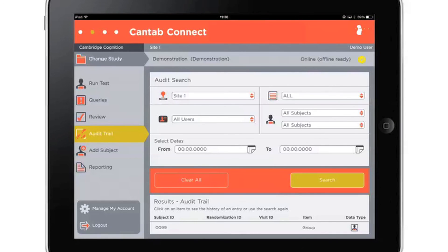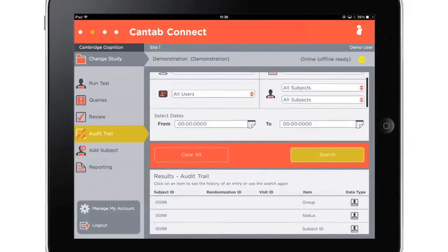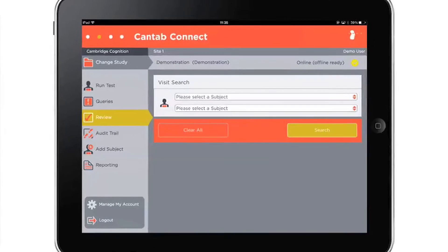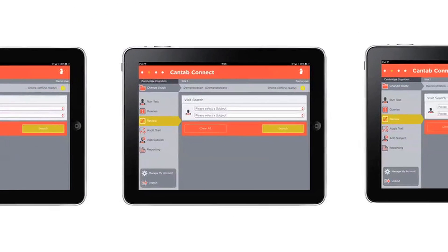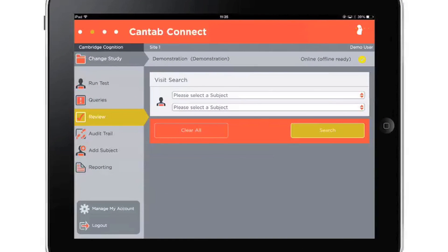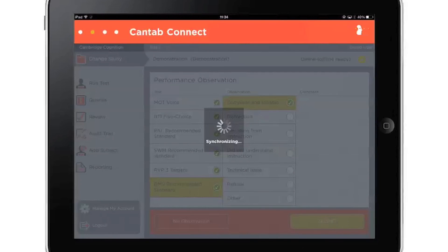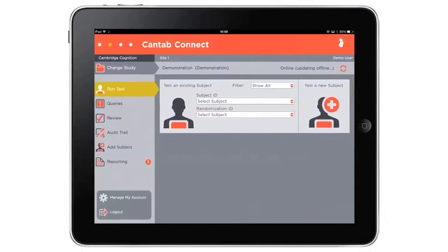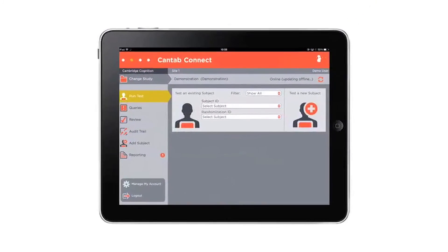An audit trail records all adjustments and tests completed on Cantab Connect. Multiple iPads can be used to collect data for a single study, all using the same configuration and assessment settings to keep data consistent. When connected to Wi-Fi, the data from each testing device is synchronized so that all study data can be accessed and analyzed in real time from anywhere in the world.